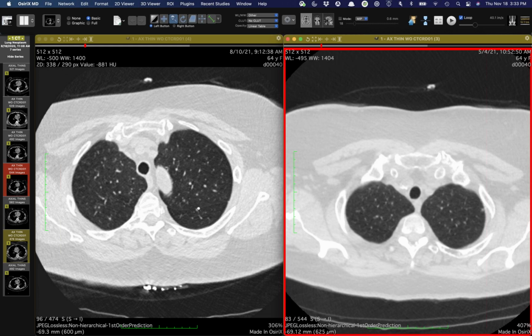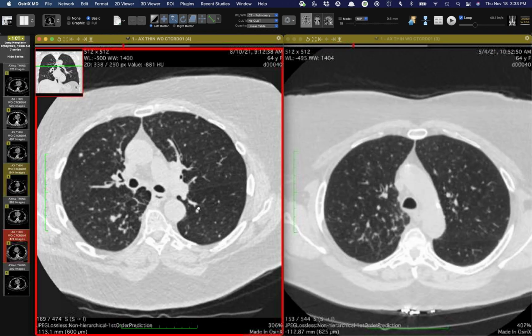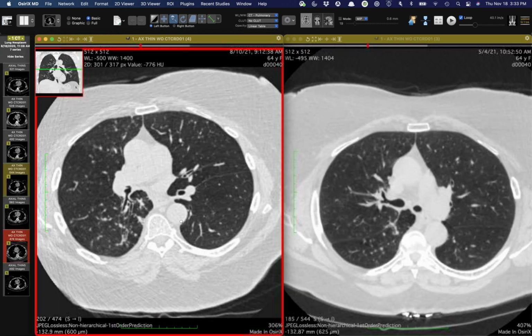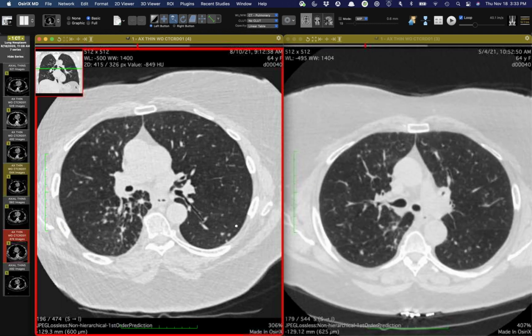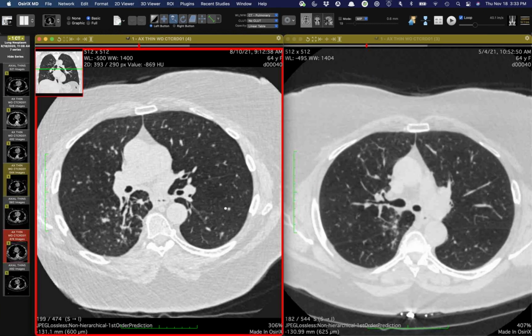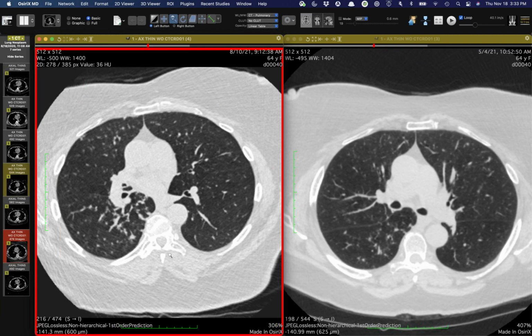It was all Langerhans cell histiocytosis. Oh no. Had the patient quit smoking before? Or did she restart smoking, or was it the chemo? Well, I don't know. I know she was smoking. There was no comment of whether she stopped and restarted.